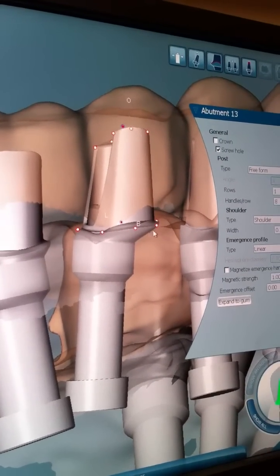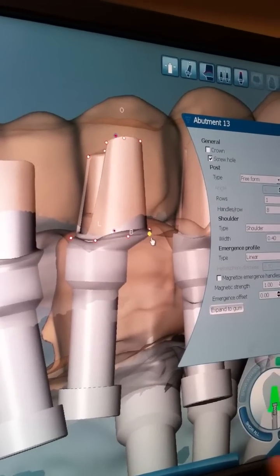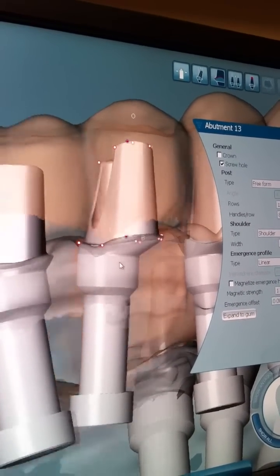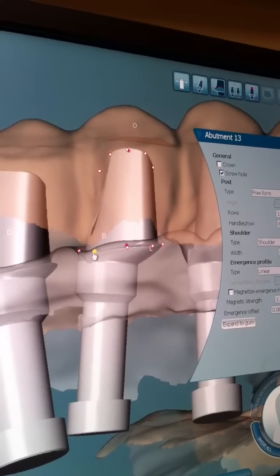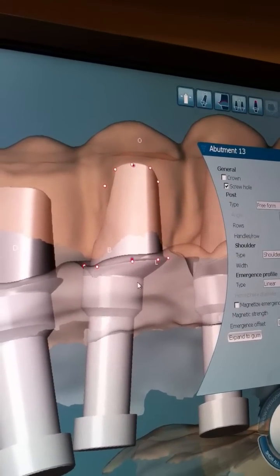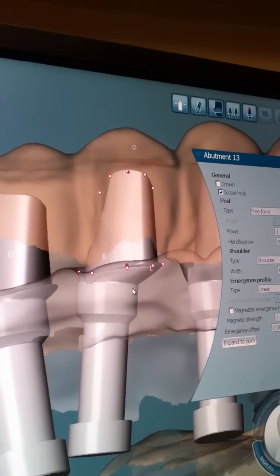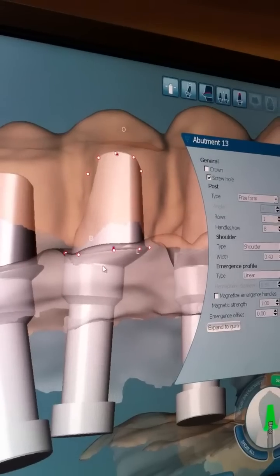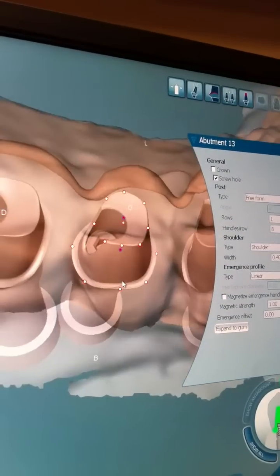So I'll do that little S shape before we make the crown. Oh, okay. No big deal. It takes 2 minutes to do. But it's just better than having it distort the distal contours. And if it was deeper, then you would be able to use that freeform because you have more space for those additional shapes over here. You just can't do it on really shallow.